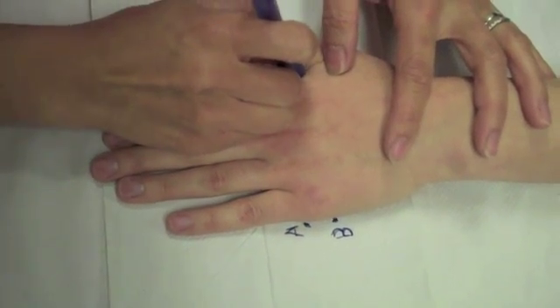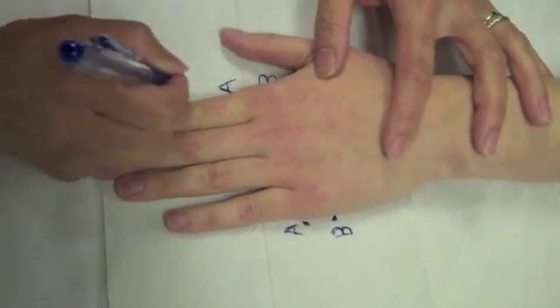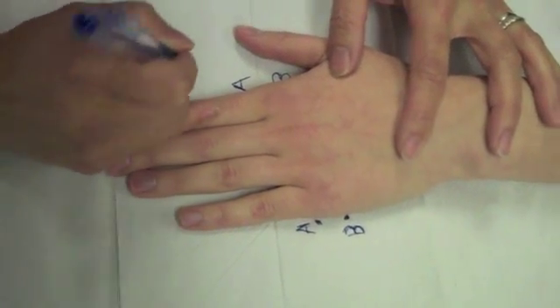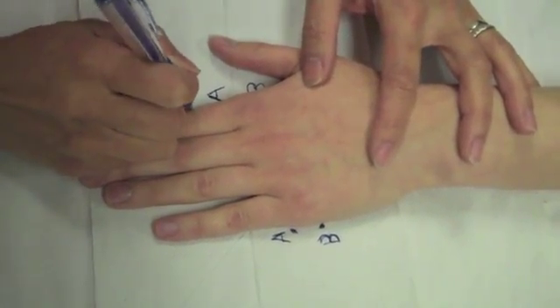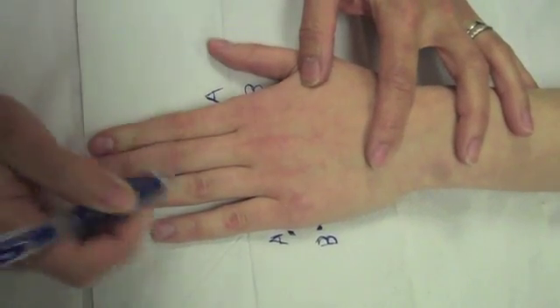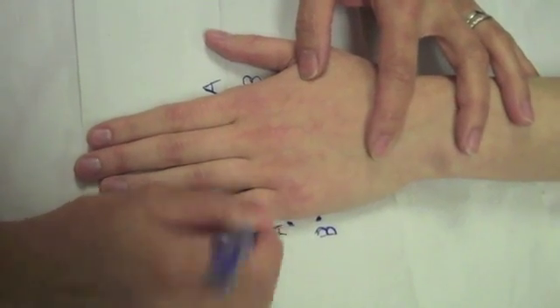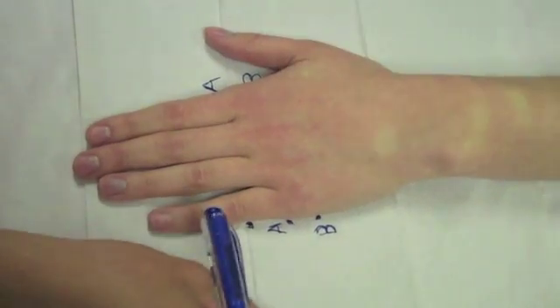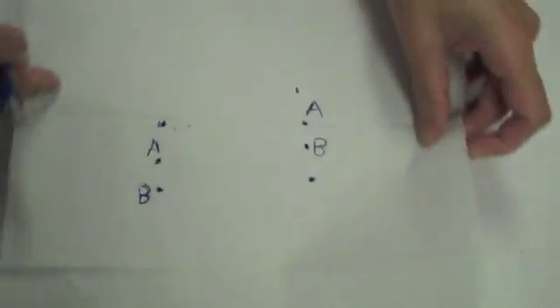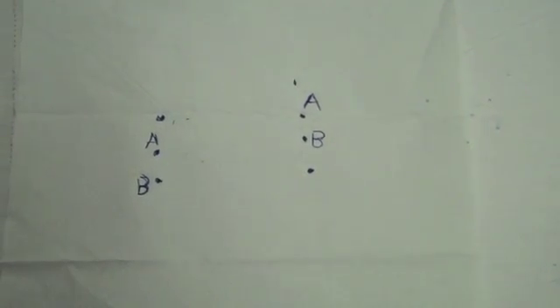Mark the first webspace by the first metacarpal. Mark just proximal to the 2nd PIP crease. Then mark just proximal to the 5th PIP crease. These are your anatomical landmarks.